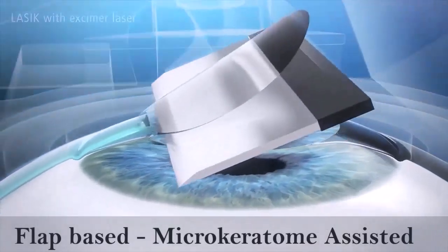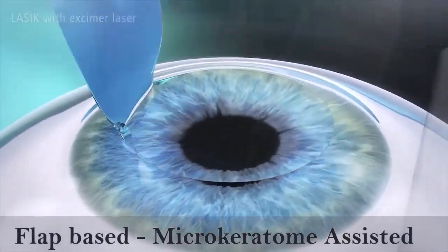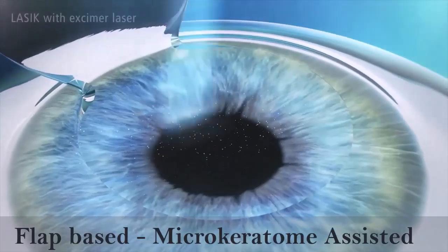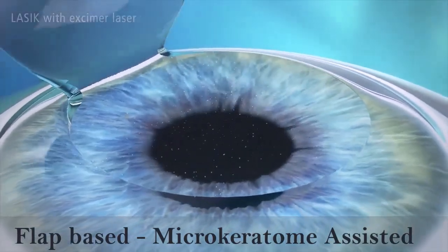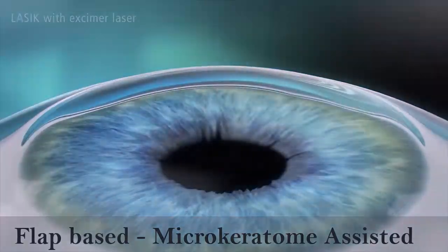the flap is created using a motorized blade, and the power correction procedure remains similar to that followed in femto.